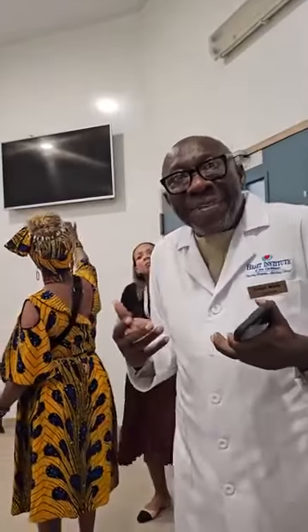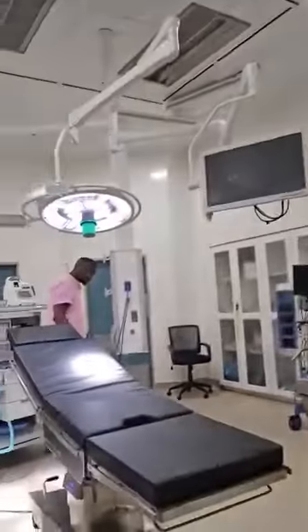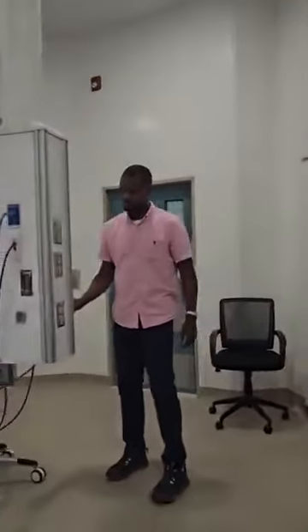We have a waste anesthetic gas disposal system. It's the only one in Jamaica. When you have lung surgery going on, some of the anesthesia is leaking out. If I'm operating for a long time, I can get cognitively slow. So what he's holding there is the waste anesthetic gas disposal system. It sucks out the gas so that other than normal fatigue, you'll be excellent.